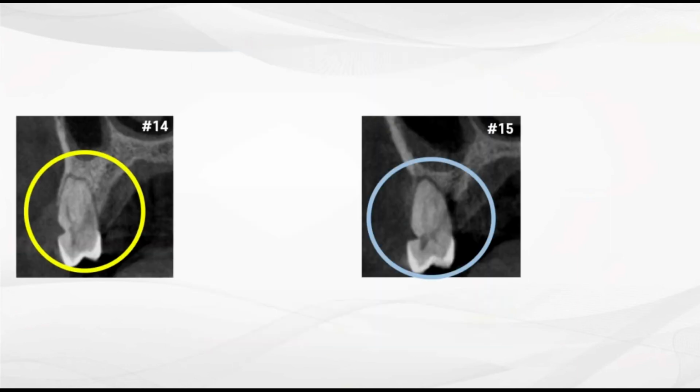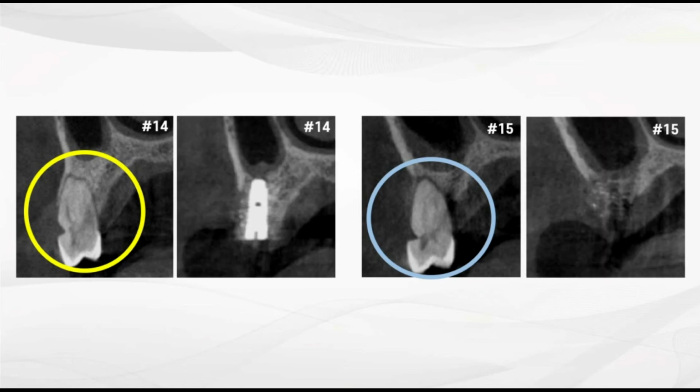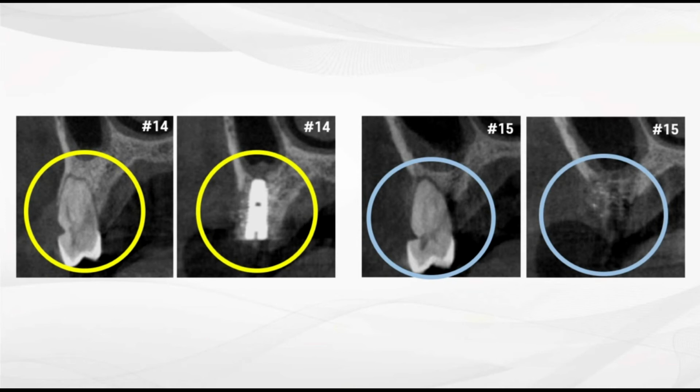This is the CT scan before tooth extraction of 1-4 and 1-5. The right picture on each side represents ridge augmentation for 1-4 and GBR for 1-5, 10 days after implantation.